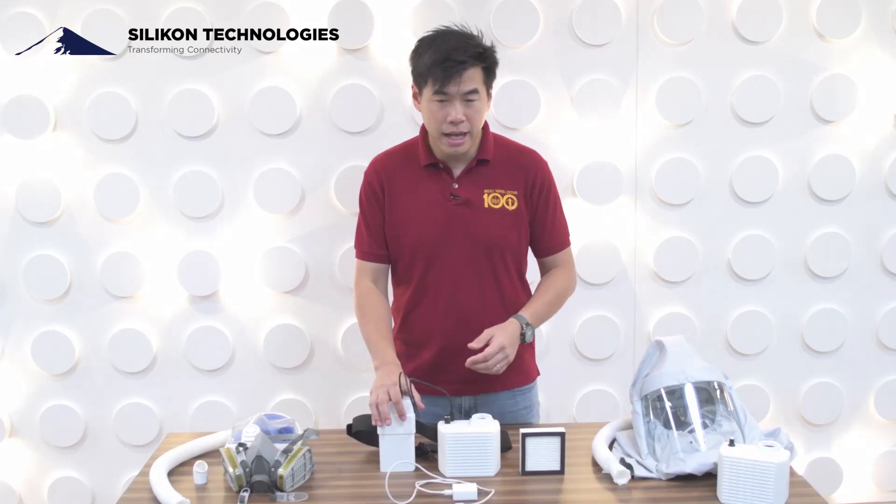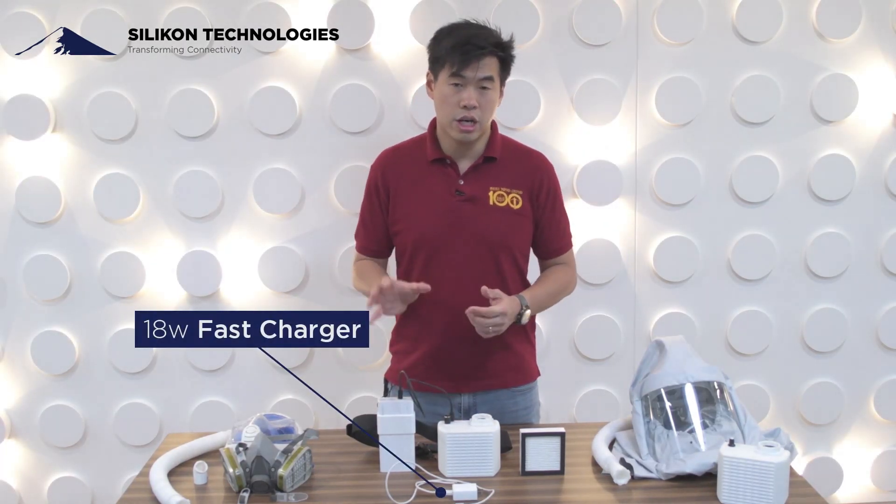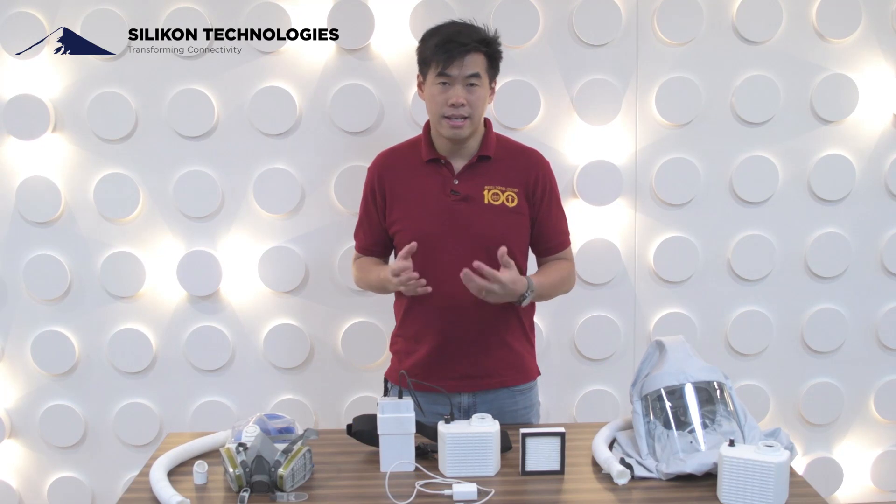And of course, with the power pack you also have a fast charger — an 18-watt fast charger that can charge the power pack in six to seven hours.